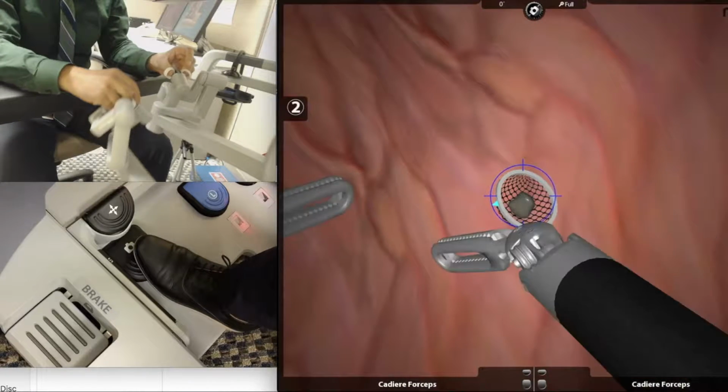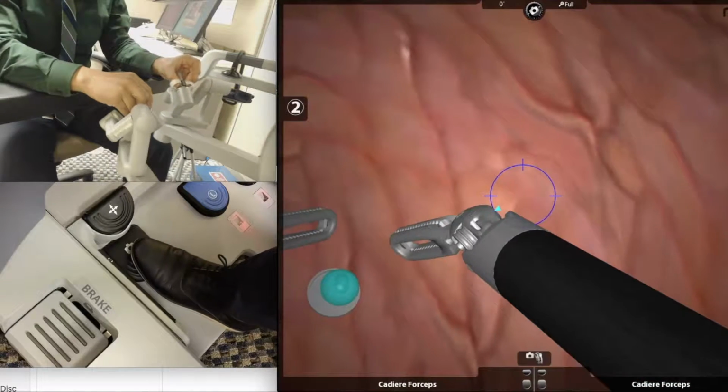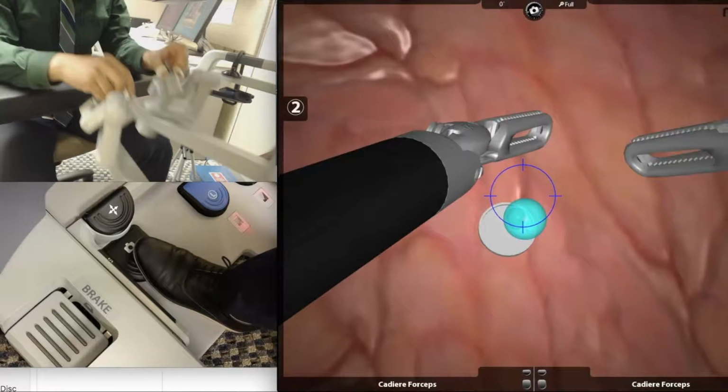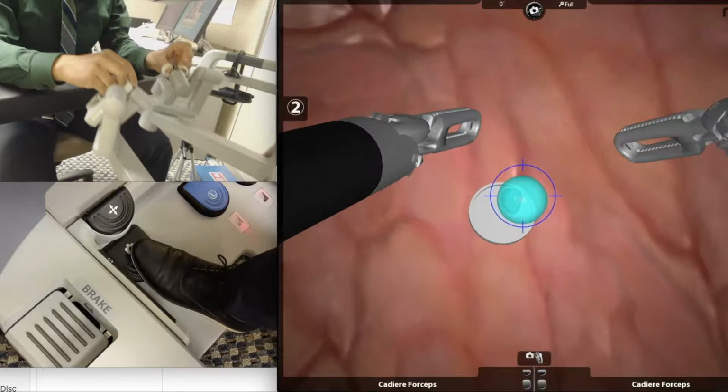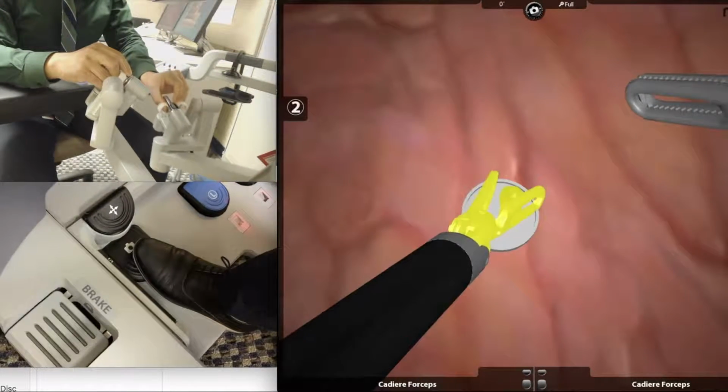Try to maintain the shortest distance between both targets. When your target is in view, keep your foot on the camera pedal and then pull yourself towards the target. This allows for more purposeful movement.